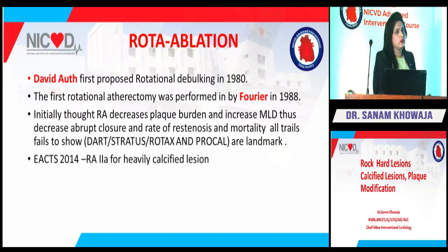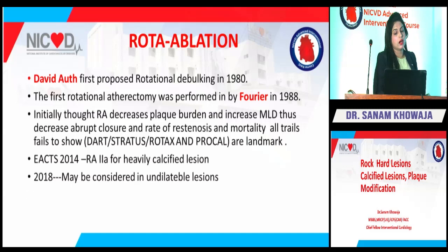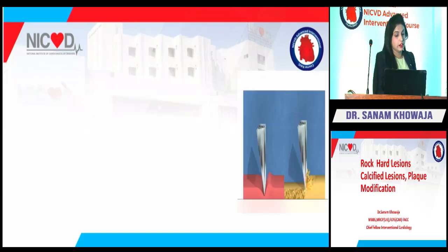So rotablation, just a quick review. Rotablation is class 2A in heavily calcified lesions in the 2014 guidelines, but now in 2018 it can be considered in undilatable lesions.